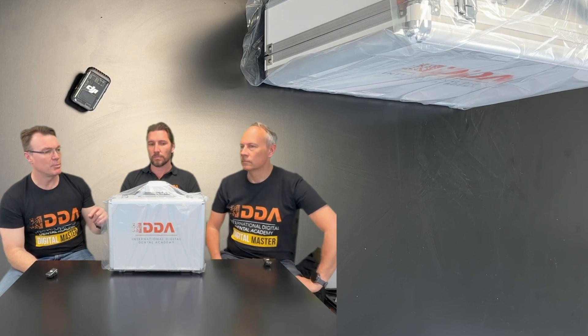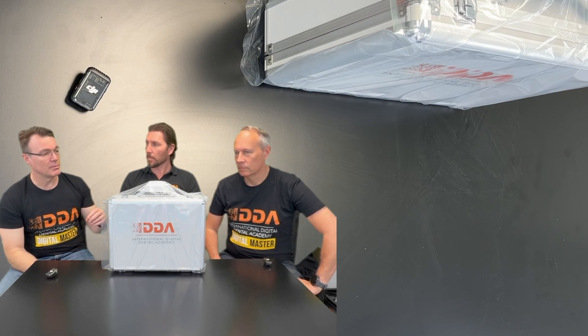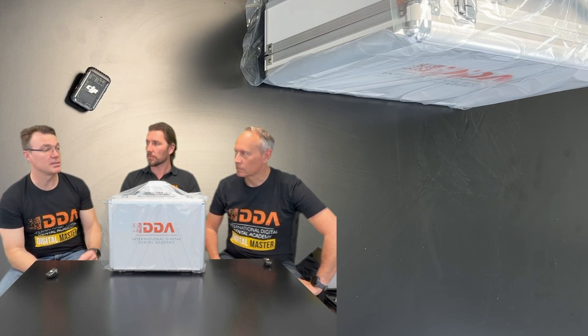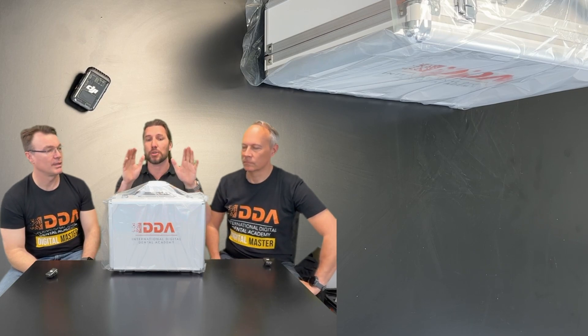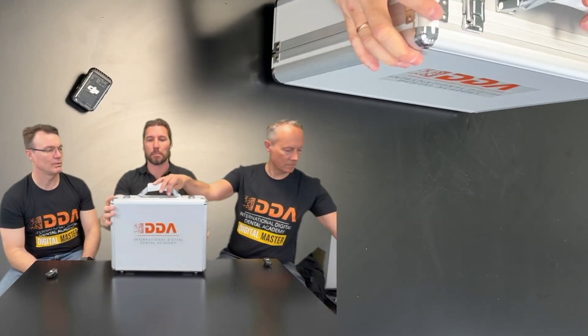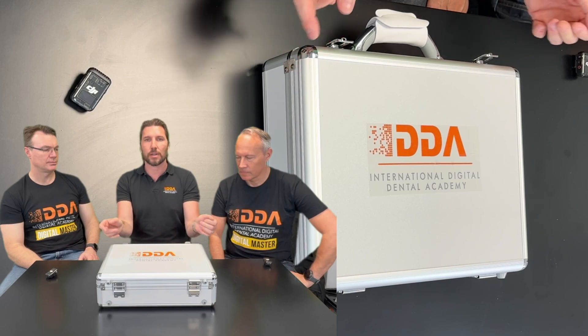It has actually got a lot of functions, and we were quite surprised when we started working with the company to develop this — that they would include all of these functions. We thought it would literally just be a scanner to replace impressions, but it's not. It is a scanner to digitize your practice. And one of the most important things when you first take it out of the box is you see this beautiful travel case, which we think is a really important thing.